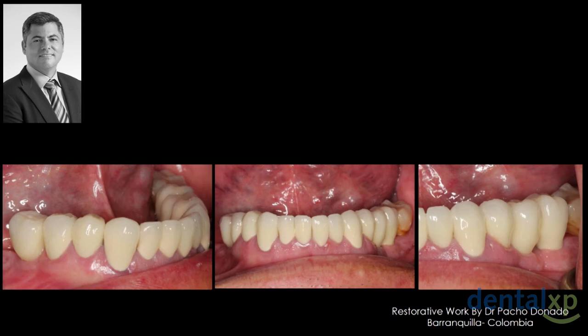He did a nice job, and you can see the fact that I was telling you that if you don't spend time in staining, glazing, crystallization, it's hard to get beautiful shades, and you get pretty much a blonde matte finish in the crowns. And this is the part that sometimes bothers me about digital technologies and milling in your office, because if you don't have somebody dedicated specifically for the shading and giving life to this ceramic, the life is going to be so limited.